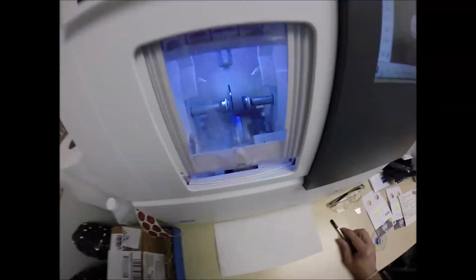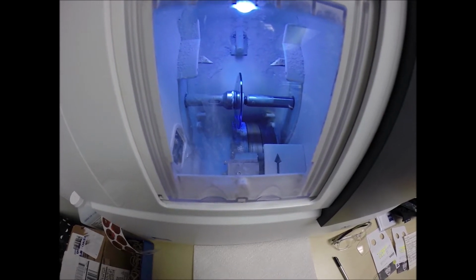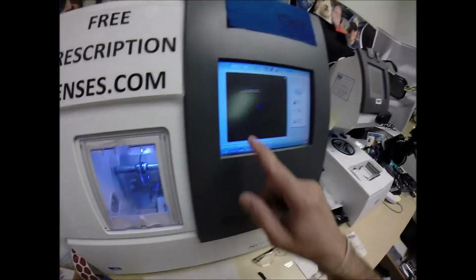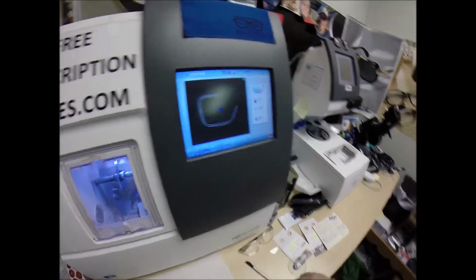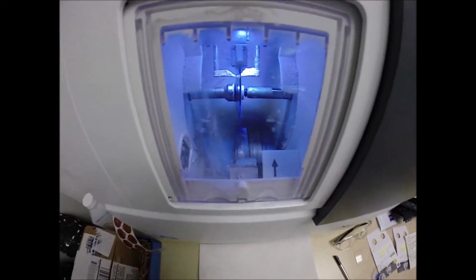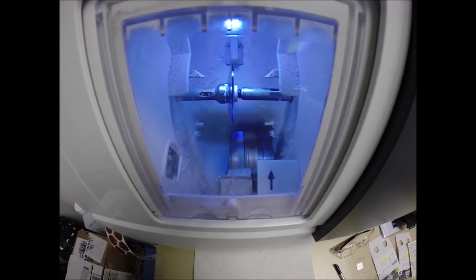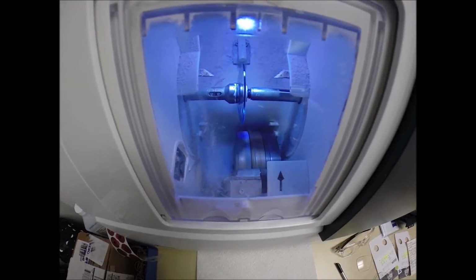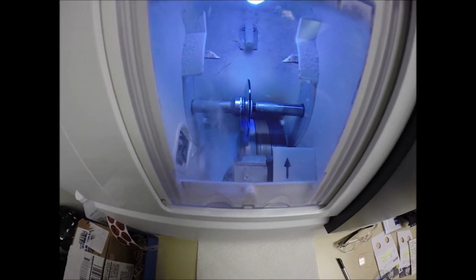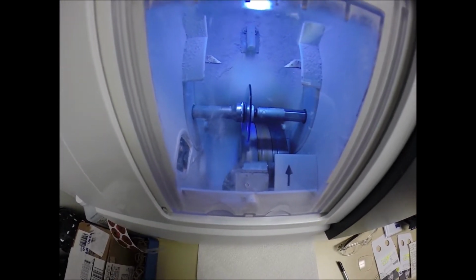Hit the green start button, the door closes, the clamp shuts, the lens is going to be traced by the two wide styluses, making sure that it's large enough to fit into the frame. And you can see as it's going around tracing the shape of the right lens. Where's that right lens? Look at that, look at that. And measuring the thickness of the lens at every point on the second go around, knowing where to place the bevel for the least amount of edge thickness showing, of which you will have none. I will be making that. Where do I find the courage to make such a statement? But with your prescription in this frame, you will have no edge thickness.